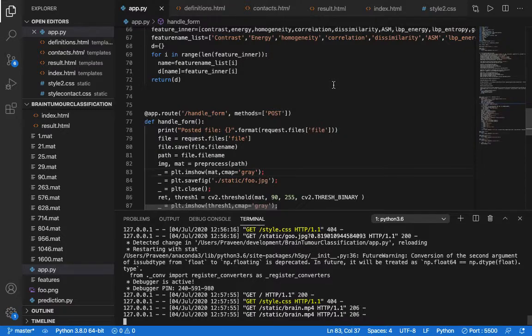So let me tell you what basically we are doing. Basically there are two broad categories of brain tumors, malignant and benign, and there are three very commonly occurring malignant tumors: gliomas, meningiomas and pituitary adenomas. The treatment and diagnosis of these three differs, and it is very difficult to distinguish between these three classes manually, and the manual process of MRI interpretation is also very time intensive. So we have tried our machine learning approaches to solve this problem.